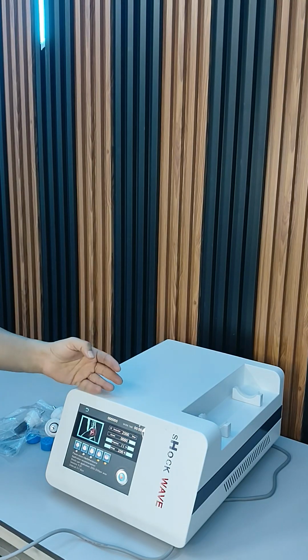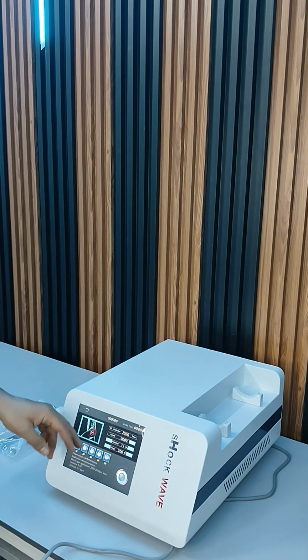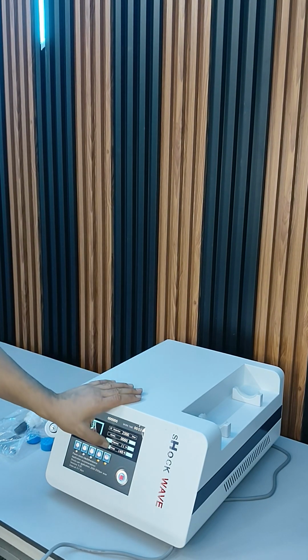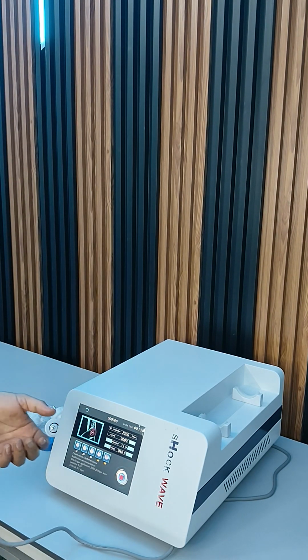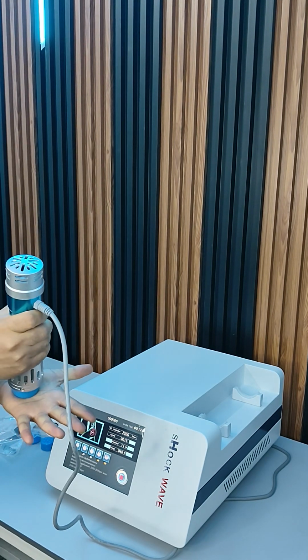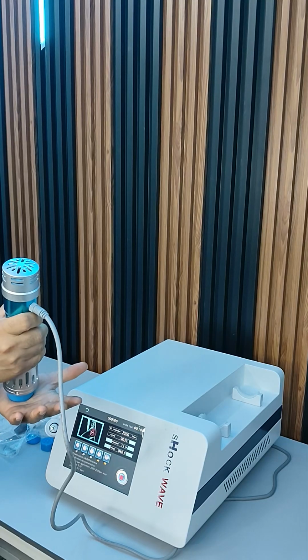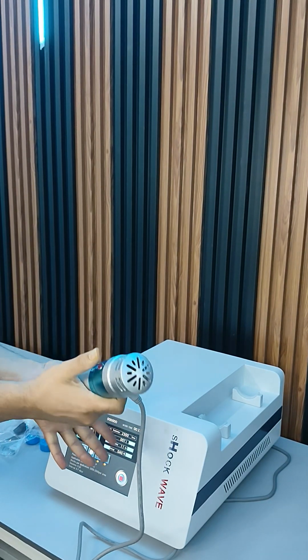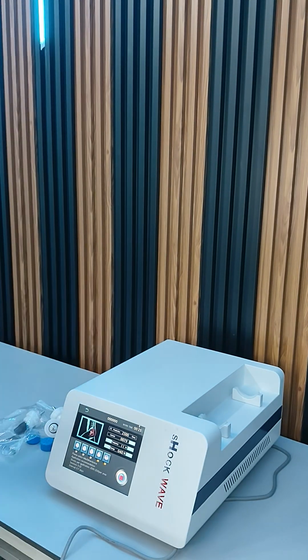And once you start, like if I start the same, I will decrease the energy, because I am not taking it on that joint, I am taking it on the hand. So that is what you can see. I am getting quite enough energy, you can see the sound. And if I want to stop in between, I can press that button.